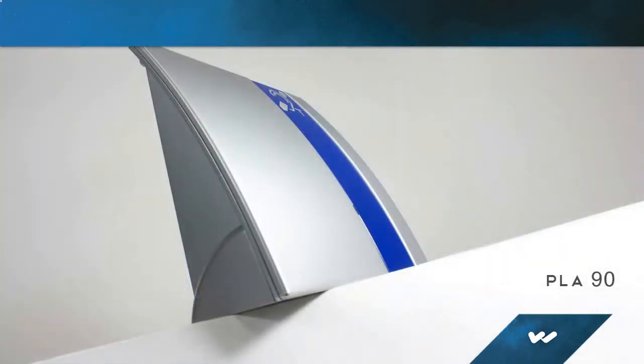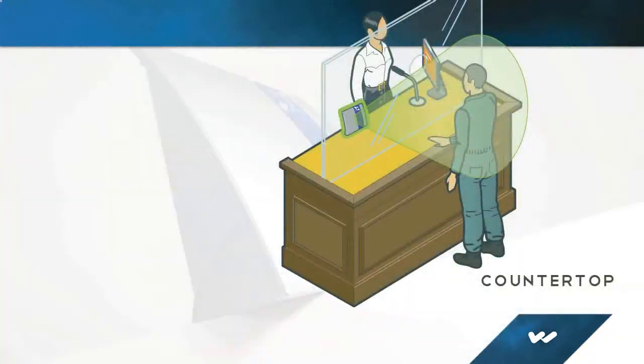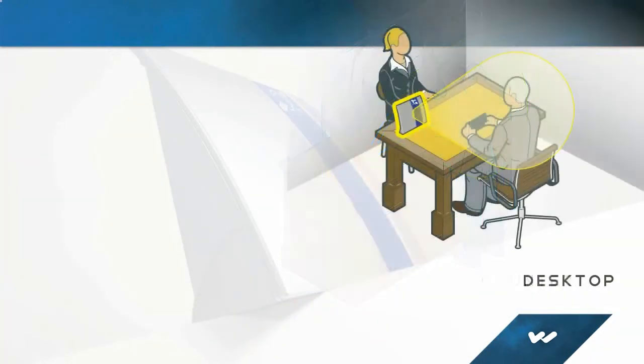Compact and easy to install, the Hearing Hotspot Counter Loop is a portable induction loop system that readily accommodates individuals with hearing difficulties at a bank teller window, information desk, store counter, or anywhere where customers or visitors need to hear what is being said.